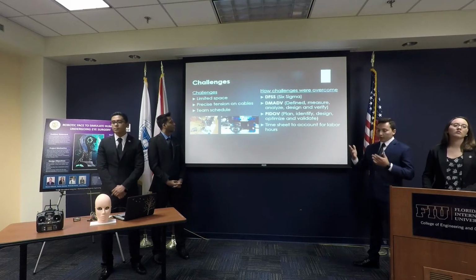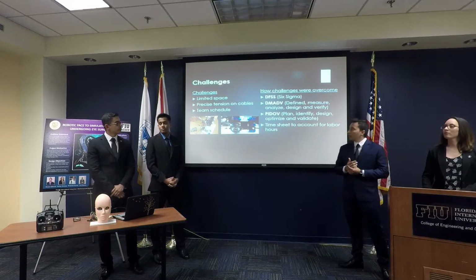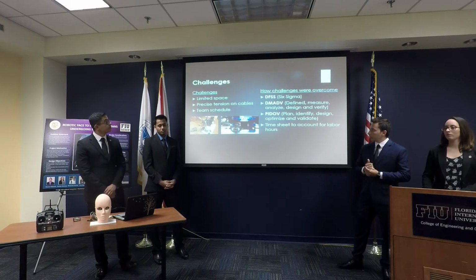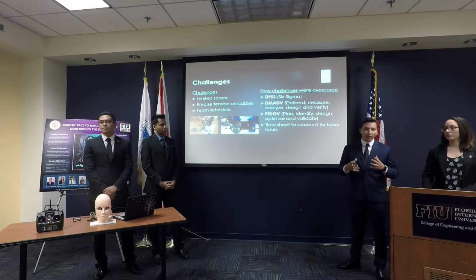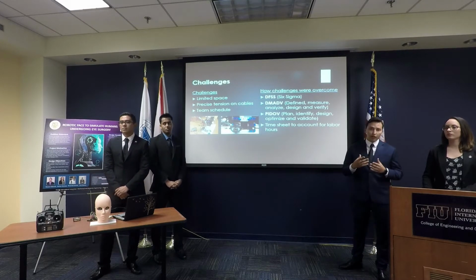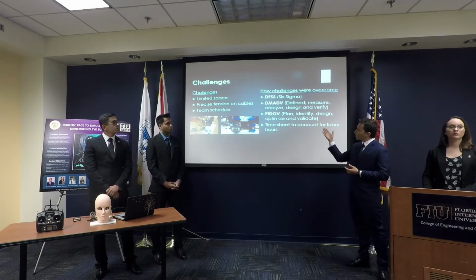As you probably know, there are some challenges involved with senior design. Some of them for us were limited space and the precision of the tension in the cable. So the way we solved this is that we wanted to apply some of the concepts that we use in industry, like Six Sigma, which is highly used in manufacturability. So we used these two different concepts.